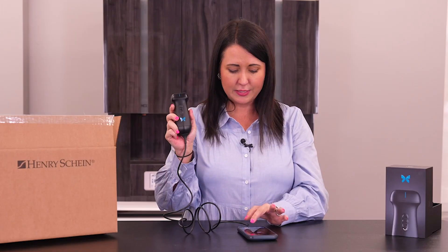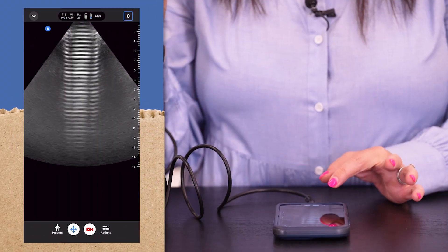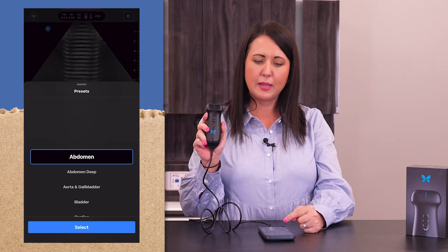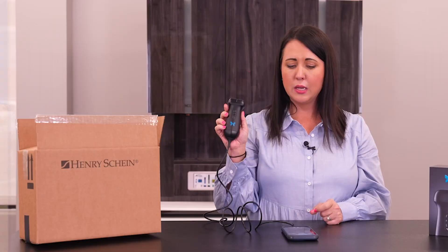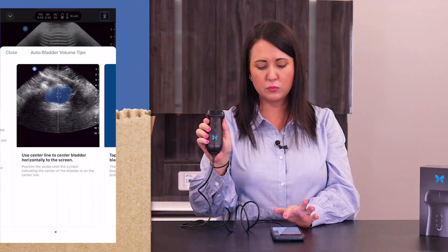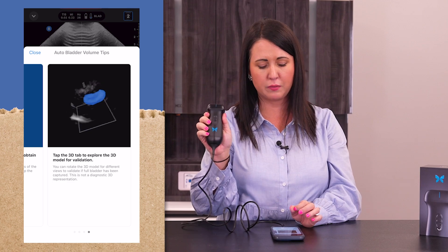Onboarding is complete. Let's get started. So we're in a live image now. All of the presets are in the bottom left corner — you can go through and select all the different types of presets from abdomen all the way to vascular. One of the things that I really like about this new IQ3 is that it's got automatic bladder scanning capability. This is a new feature and this is a big deal. It walks you through step by step where you're going to get the best image for a bladder volume.